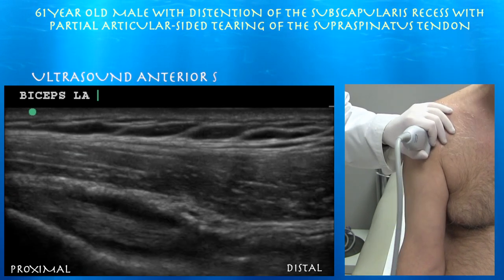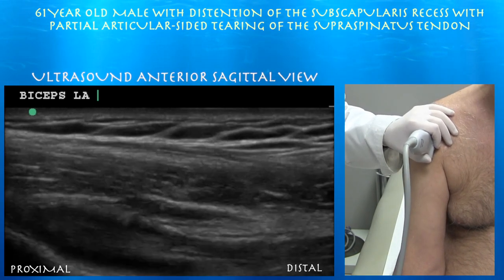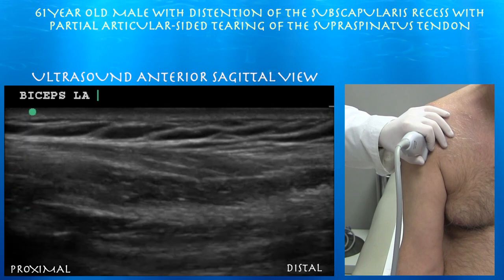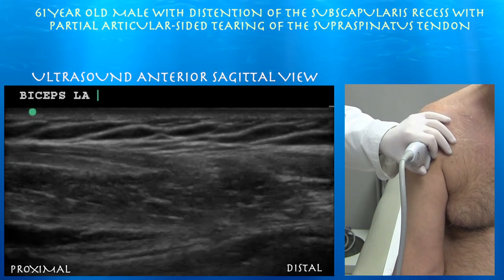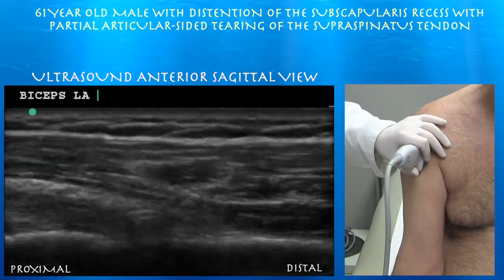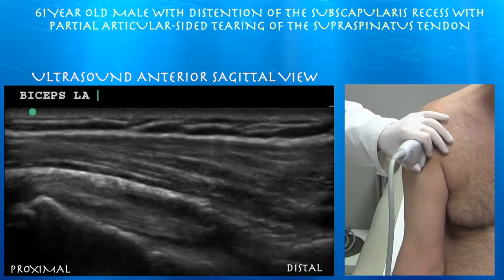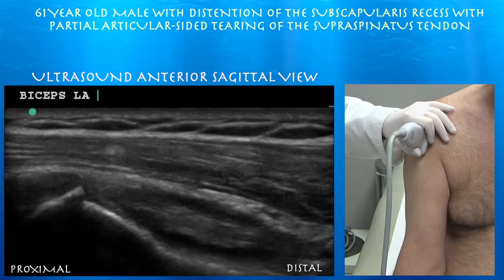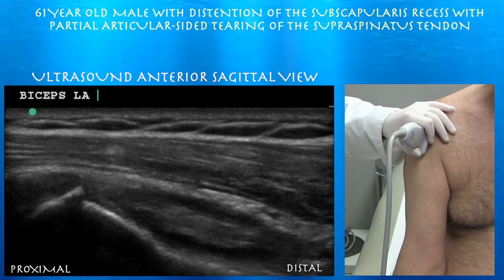Looking at this in long axis — here's the biceps tendon. You can see a fair amount of fluid around it. And again here you can see the fluid basically surrounding the biceps tendon.